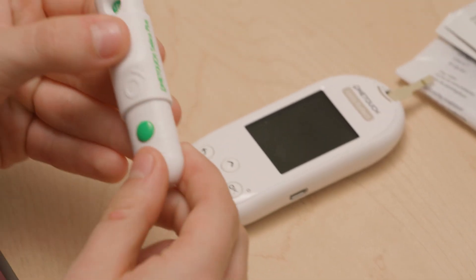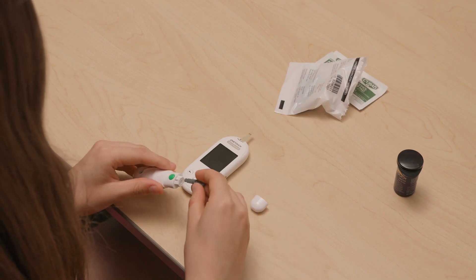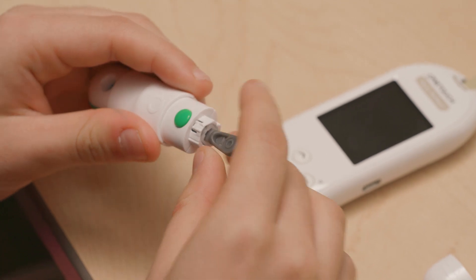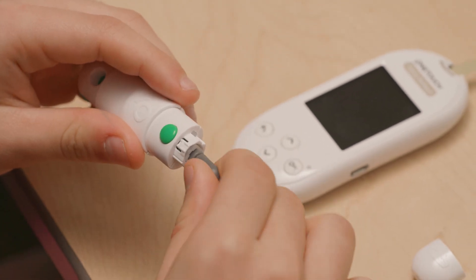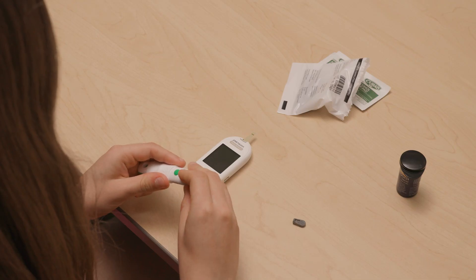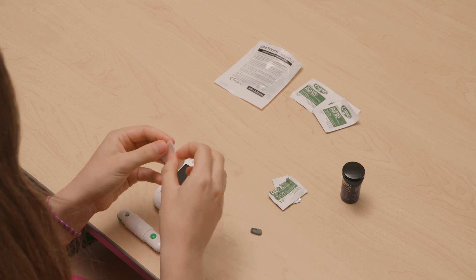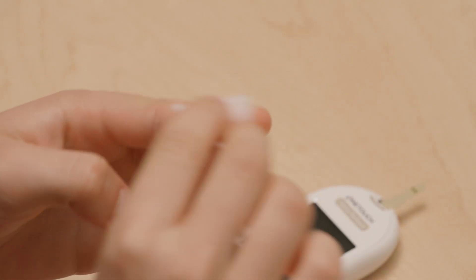Twist the cap off — this is the top closest to the green button — until it pops off. Put the lancet into the device; the skinny side goes into the device. Take the lancet and twist the circle end until it becomes loose and pull it off. You will see a tiny little needle. Snap the cap back on. Wash your hands with soap and warm water or use an alcohol swab. Make sure fingers are dry before testing.